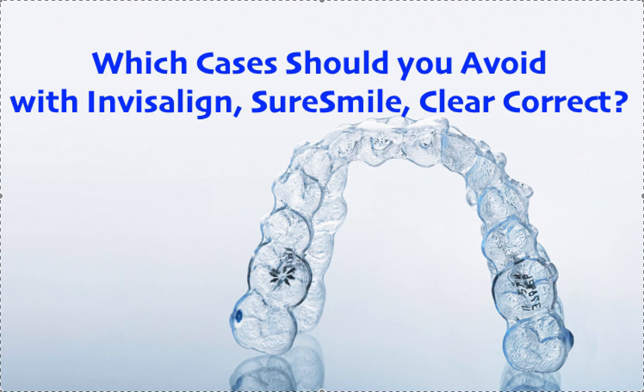Anyways, we're just going to do a brief generalization. If you stick with it, it'll keep you out of trouble. Of course, a lot of it depends on which system you're using. With Invisalign, you can take more things than you can with SureSmile, ClearCorrect, or Reveal. There's definitely a lot more cases you can predictably take, so you have to be a lot more selective and careful if you're not taking Invisalign.